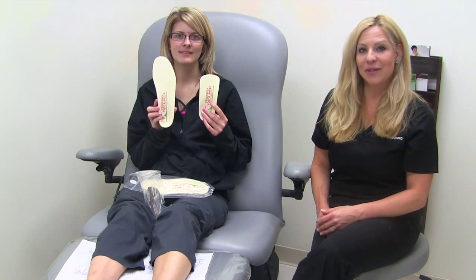These orthotics are designed by a podiatrist. They are super thin, lightweight, sturdy and durable. The great thing about them is they are not as costly as custom orthotics.